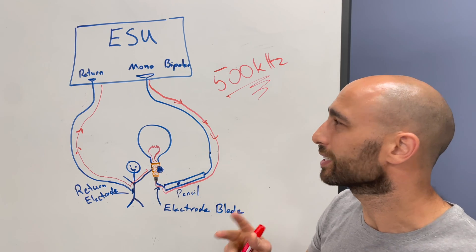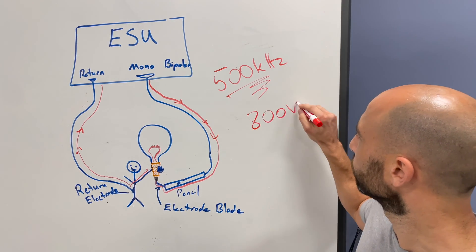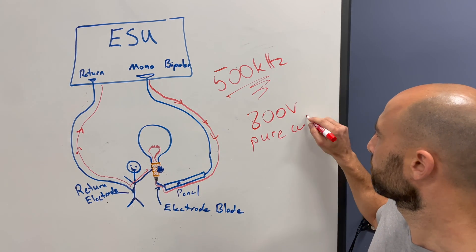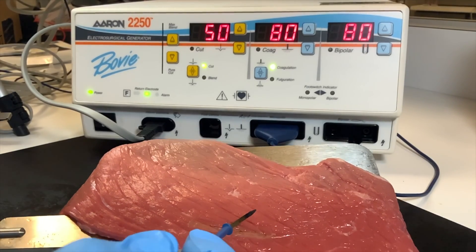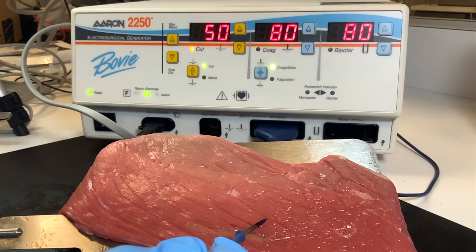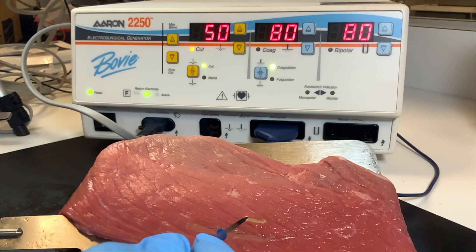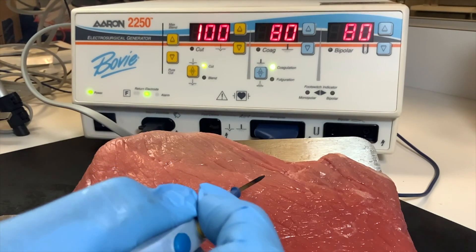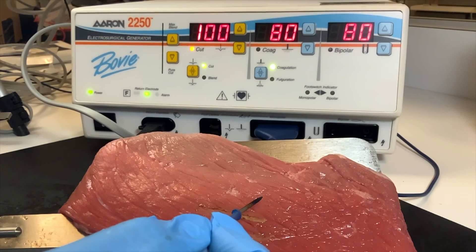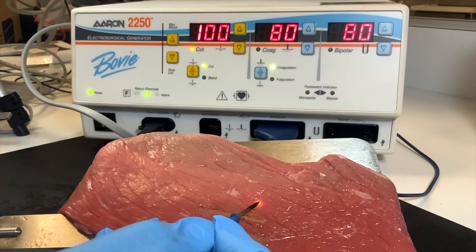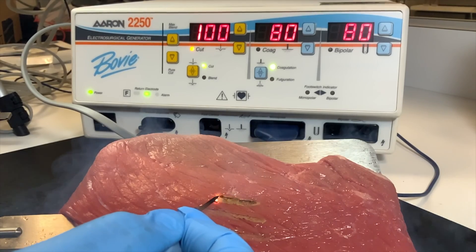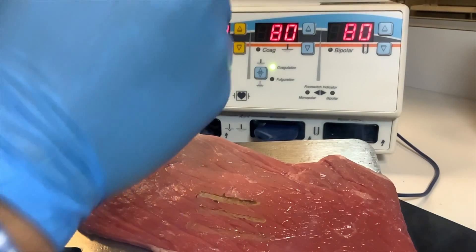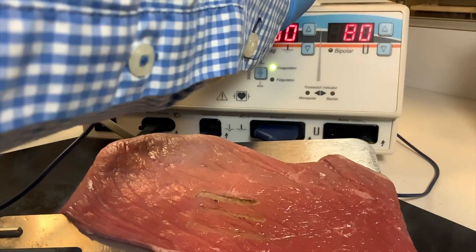As a general rule of thumb, you can expect around 800 volts for a pure cut mode. In monopolar mode, you have two options: cut or coag. Cut is going to be shown at two different levels — now doing a cut at 50 watts, and now you're going to see a cut at 100 watts. The cut at 100 watts is going to have a larger impact on the tissue, more destruction, because it's heating the tissue up more and increasing the current going through the meat.